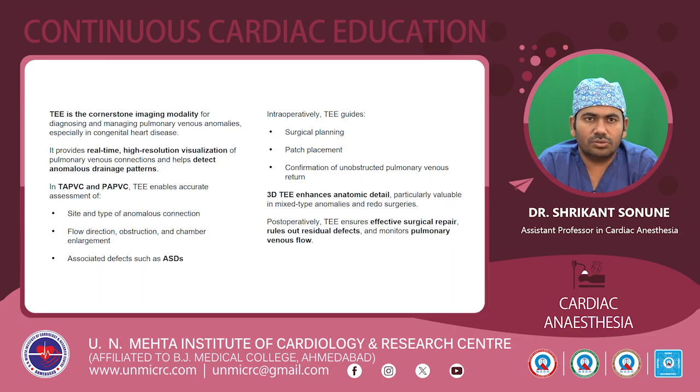We have to look for any associated defects such as ASDs. For the intraoperative assessment, the TEE is helpful in the surgical planning, the placement of the patch, and the confirmation of unobstructed pulmonary venous return after the surgical repair. So 3D TEE can be used. It enhances the anatomic details, particularly valuable in mixed type of anomalies and in case of redo surgeries. So postoperatively, TEE ensures the effective surgical repair, rules out residual defects, and can monitor the pulmonary venous flow.